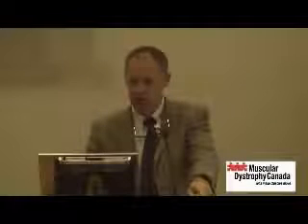So we're using personal protective equipment, which is certainly what we do in the hospital. He's taken his own breath in, and Kathy is stacking breaths on top of each other. And then he's holding the volume in to get the peak flow measure in, and then doing a manually assisted cough. He's been doing that for about 10 years. He's very, very skilled at it.